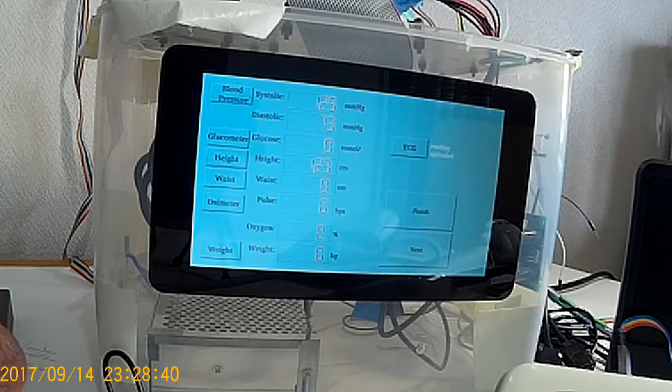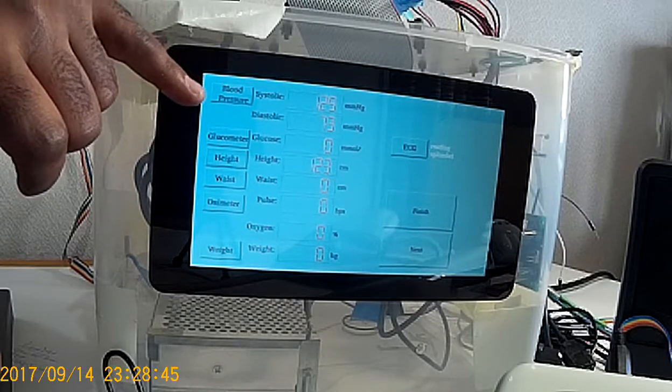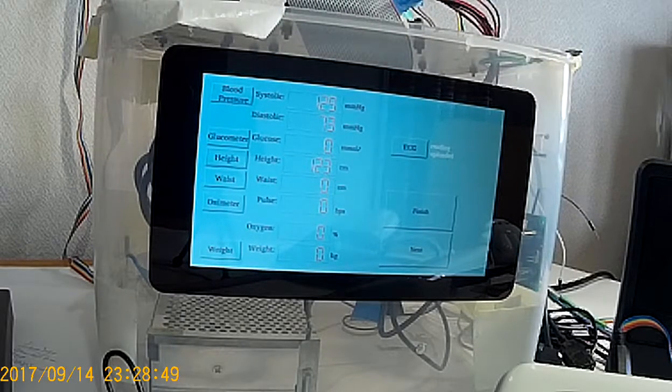and among others. Similarly, we have the blood pressure measurement here, as we have seen earlier, and on this side we have the ECG, which is a very portable electrocardiogram. It can be used by holding it in both hands in our palm, and in that way we can measure the electrical activity of our heart.